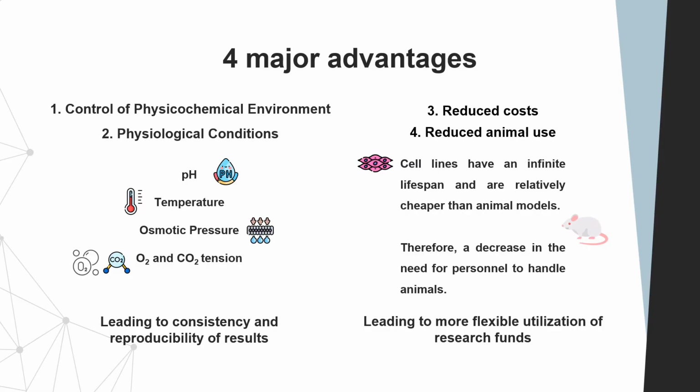In vitro cell culture actually provides researchers with a very controlled environment, where various experimental conditions can be manipulated and monitored by you, such as temperature, pH, nutrient availability, substrate materials, and also the presence of different signaling molecules that you can add in the media to control or to study specific aspects of cellular behavior or their responses to different kinds of external stimuli.